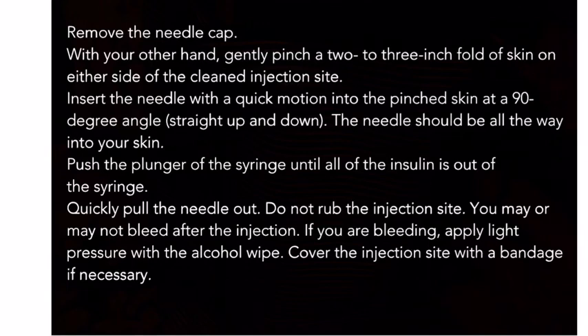Remove the needle cap. With your other hand, gently pinch a two to three inch fold of skin on either side of the cleaned injection site. Insert the needle with a quick motion into the pinched skin at a 90-degree angle — straight up and down. The needle should be all the way into your skin. Push the plunger of the syringe until all the insulin is out, then quickly pull the needle out.